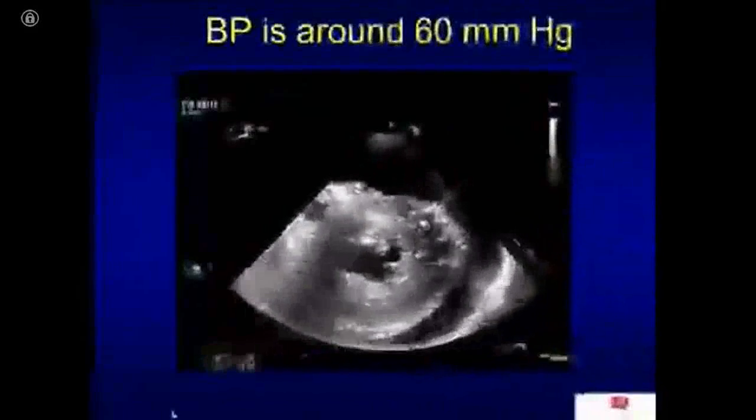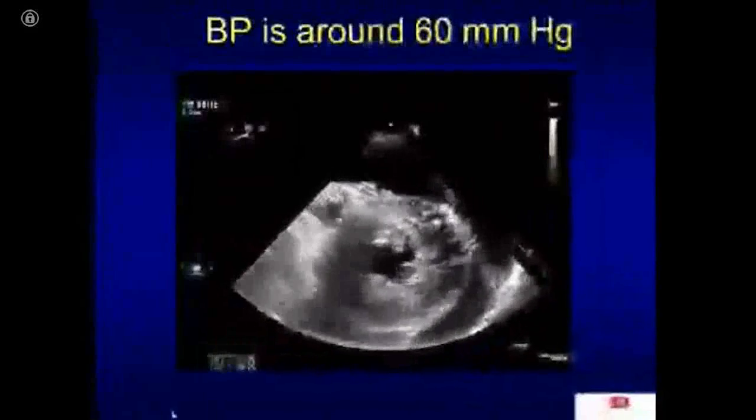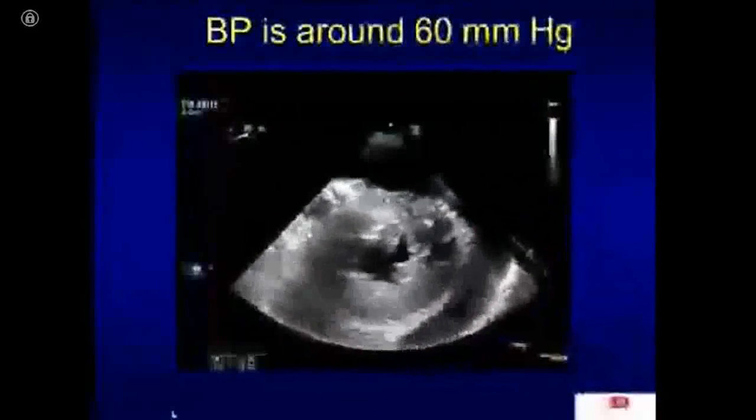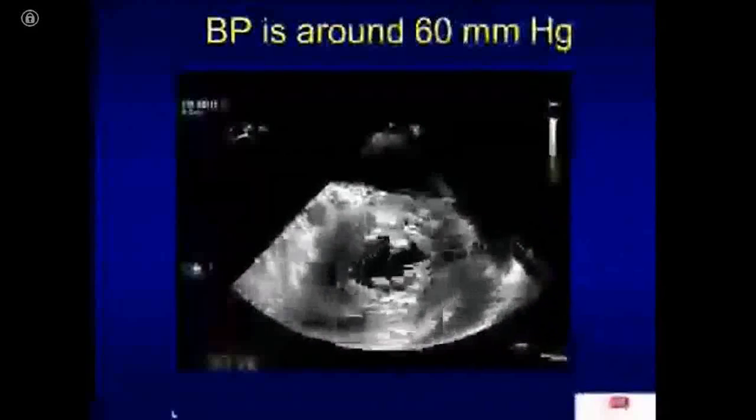So every hour you are bleeding more than 500 cc an hour. Is that what was happening? Yeah, this is totally fine. What you didn't do there, I would, did you shoot the venogram of that left inferior? What happened to the left inferior?